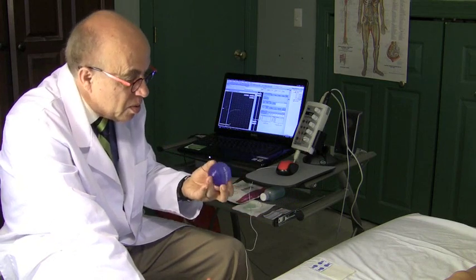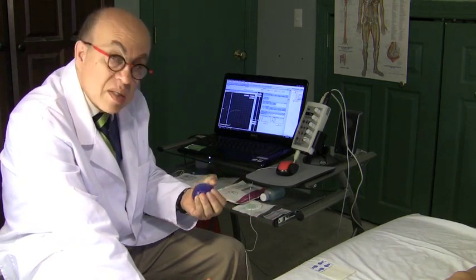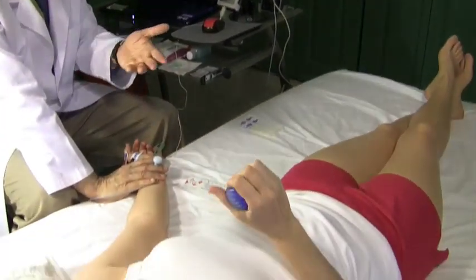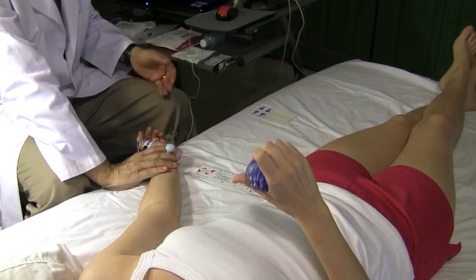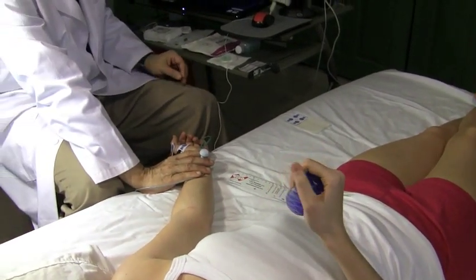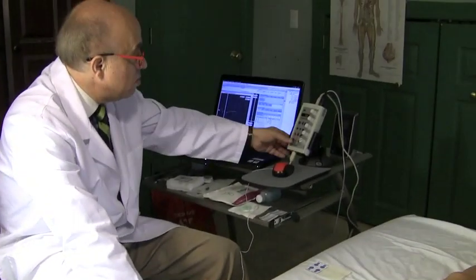Here's a little ball here that we use, and we ask the subject to squeeze it. That's all we do, and that distracts them. So grab this, and obviously have them squeeze it with the right hand if you're doing the left hand. And that distracts them and maybe gives us some better responses.